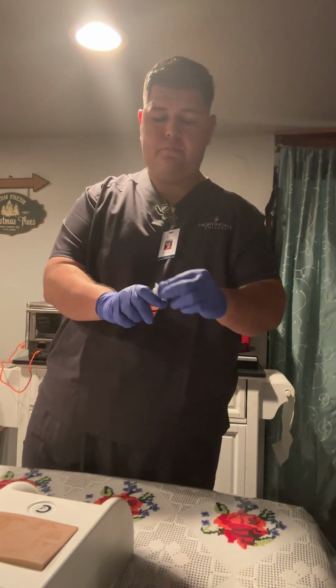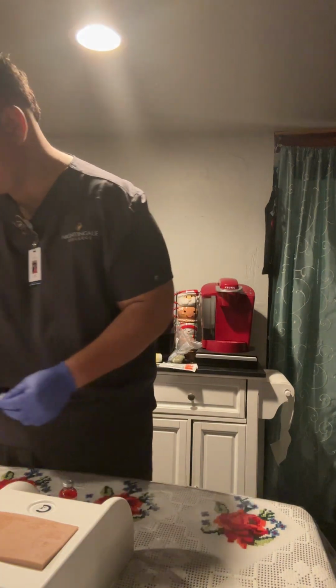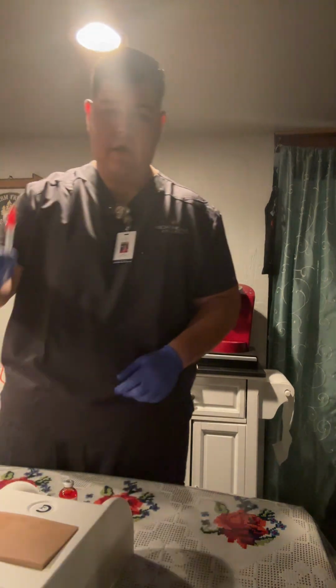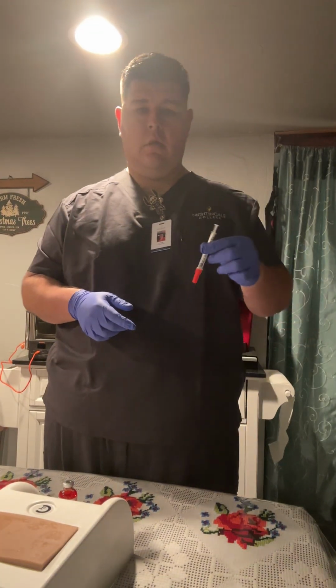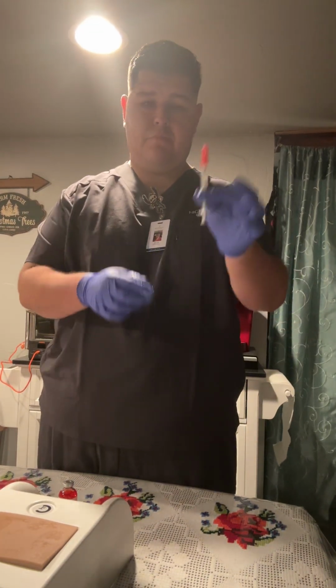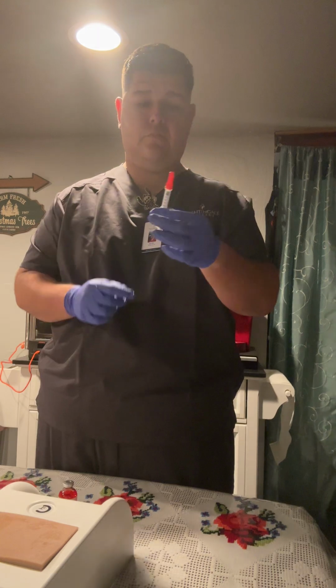Alcohol prep pad here. Discard that. I have my syringe. So I want to hold my syringe up like a pencil, needle up, cap on. I want to then draw 0.1 milliliters of air.